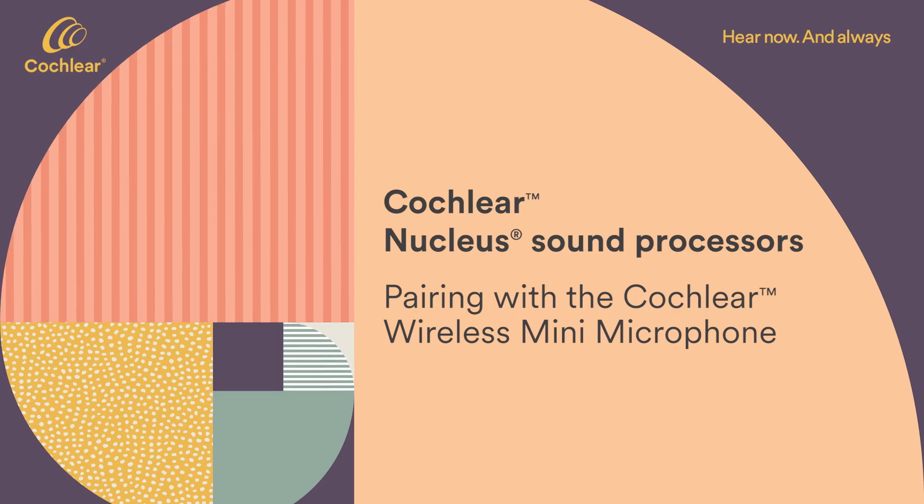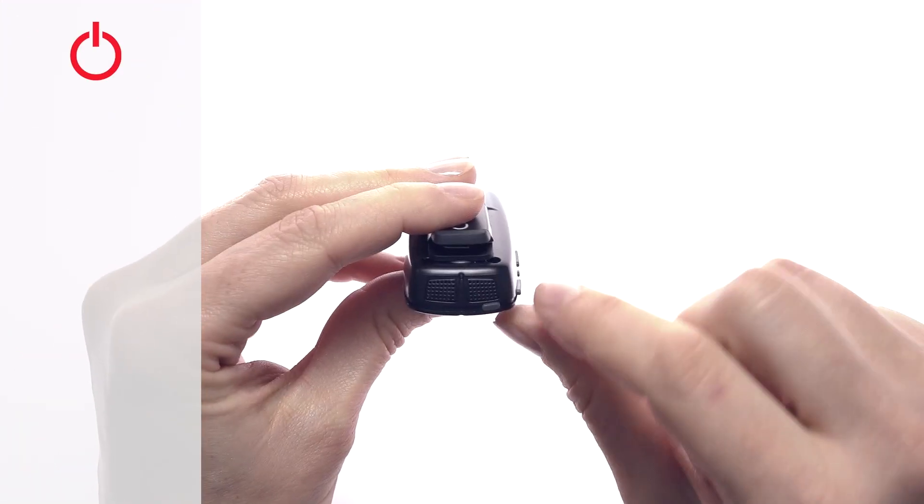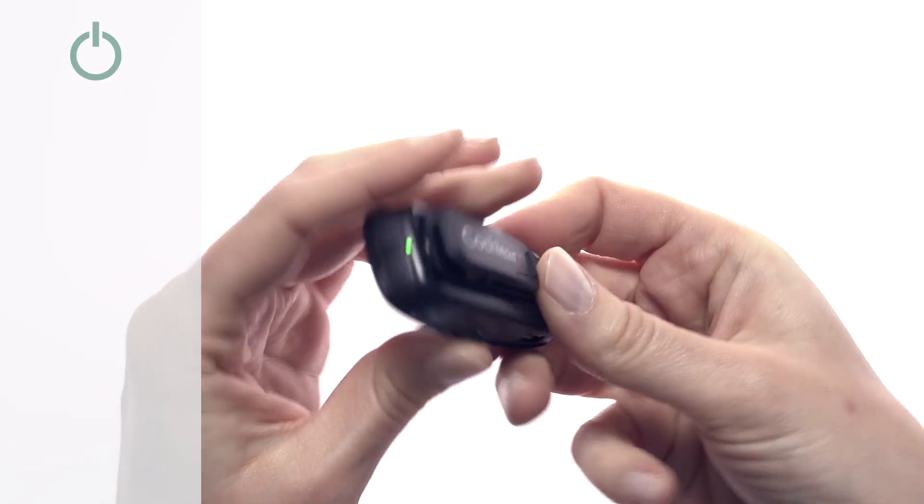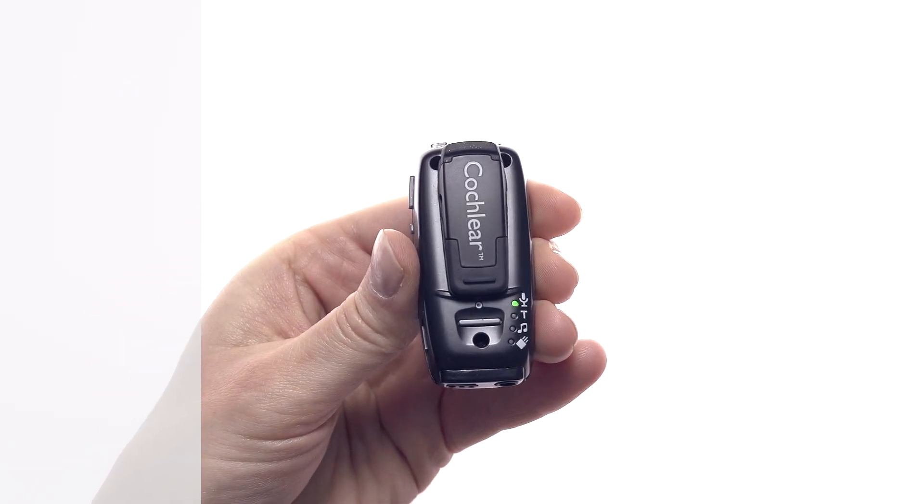To pair your mini microphone, firstly turn off your sound processor. Turn on your mini microphone by pressing and holding the on-off button on your mini microphone for 2 seconds until the LED turns green.